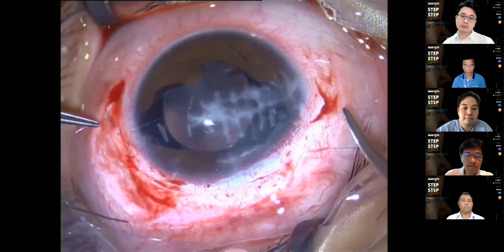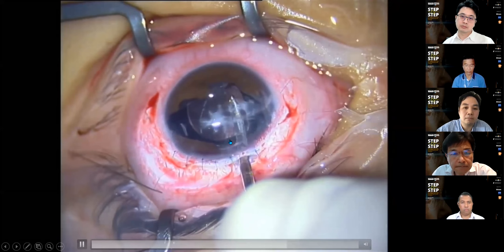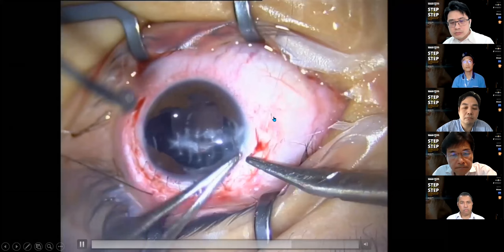All right, what I do normally in cases like this, I won't fix the suture first. I will close the wound, remove the viscoelastic and make sure the eye is in a firm condition, almost like normal, without viscoelastic. Then I use the other end of the suture, which is a curved needle, to fix it.